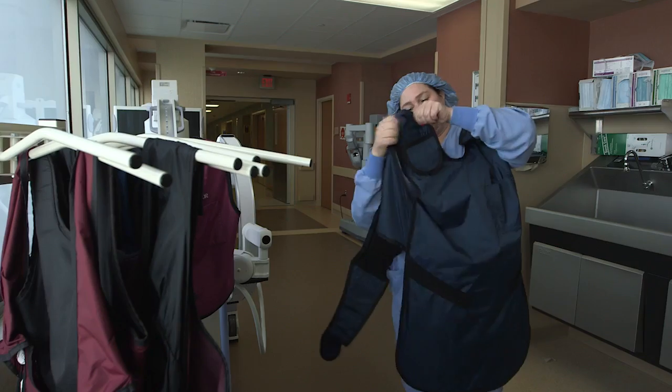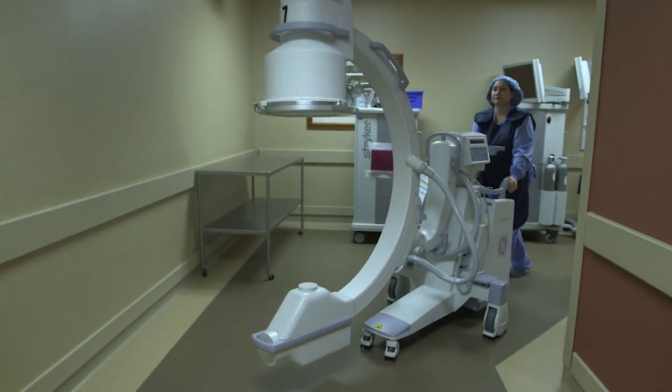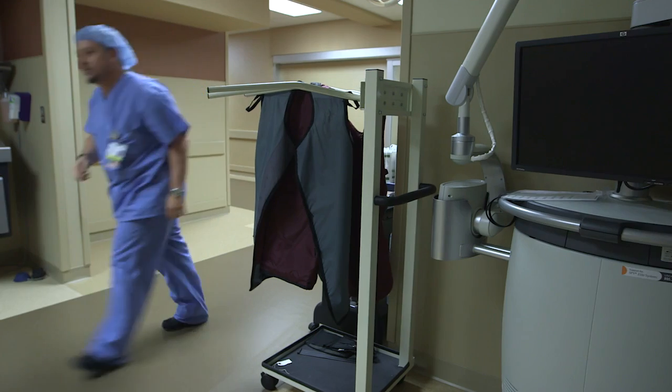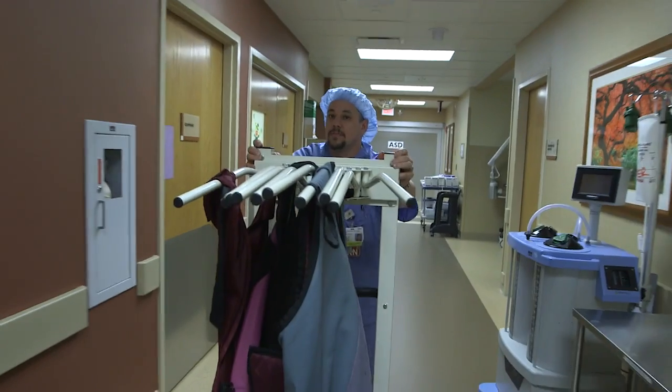When it comes to hospital-acquired infections, we have to manage that risk, and lead aprons are a unique piece of equipment in the hospital because they go throughout the house. If I have a surgery where I'm going to need lead, I will go to the hallway where there's the rack and just grab a lead apron and put it on, and so will the other staff in the room. Then you wear it during the case, and then when the surgery is done, you go hang it back up on the rack. They can come into contact with patients.